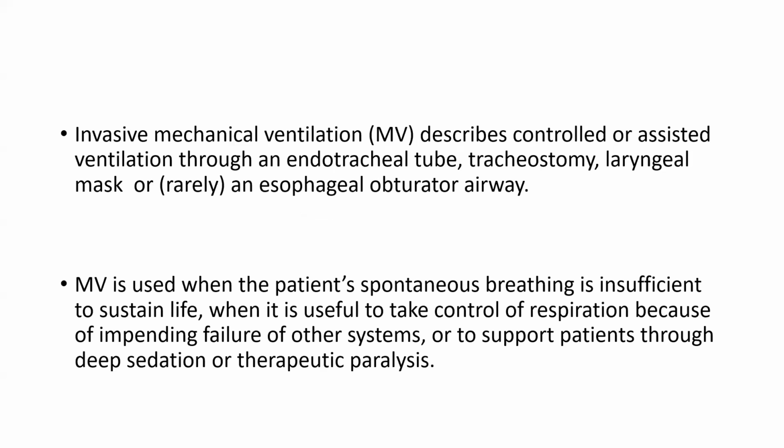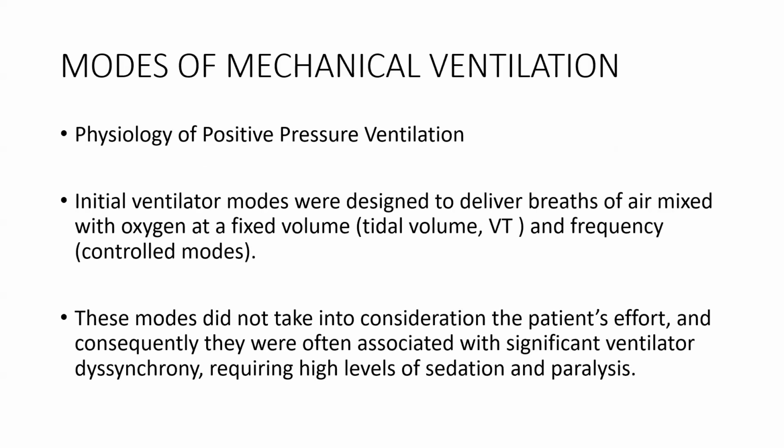Invasive mechanical ventilation describes the control or assisted ventilation through an endotracheal tube, tracheostomy, laryngeal mask, or esophageal obturator airway. Mechanical ventilation is used when the patient's spontaneous breathing is insufficient to sustain life, when it is useful to take control of respiration because of impending failure of another system, or to support the patient through deep sedation or therapeutic paralysis. So we'll see what the modes of mechanical ventilation are.